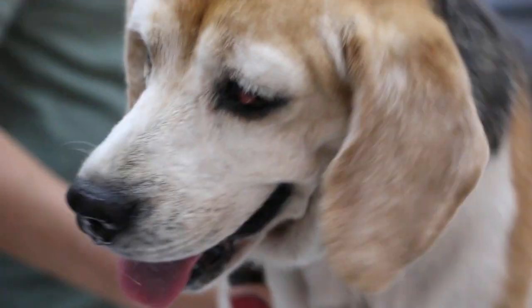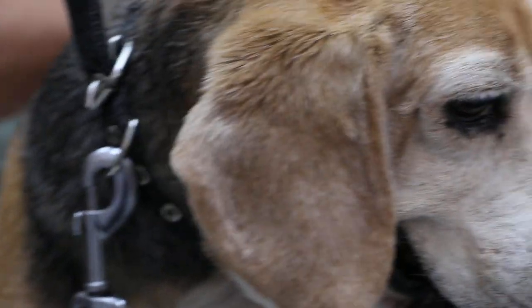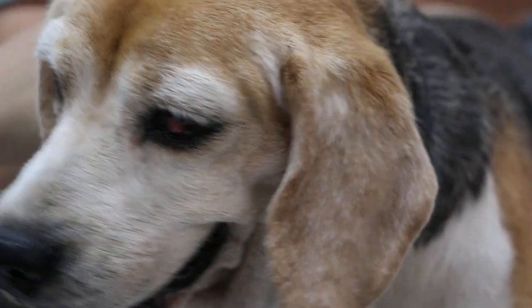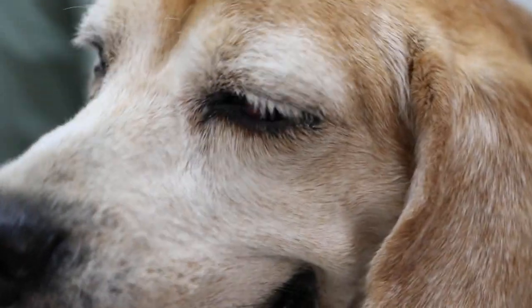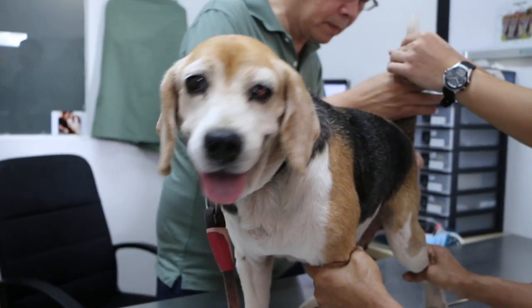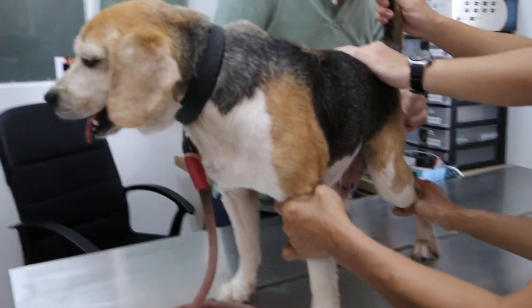I'll take the temperature first. Put him on the board, keep him cool. Hold that. Here we take the rectal temperature, we normally hold the tail up. Normally this dog is okay, it doesn't bite. Yeah, it's a barking dog. A barking dog doesn't bite. It's true.